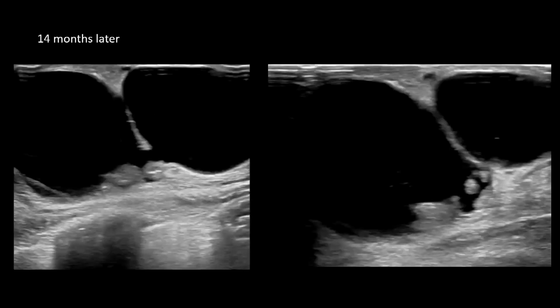So at this point, we told her that, okay, we're going to have to vacuum this area out, or you're going to have surgery. She's refusing surgery. So we perform a 9-gauge vacuum of the residual intraductal mass again. And this was an intraductal papilloma. So you can see that these can be quite difficult management for the patient and for the radiologist at times. And so here she comes back again 14 months later, tons of fluid. These are clearly palpable, causing her quite a bit of symptoms, and she just keeps wanting the area drained.